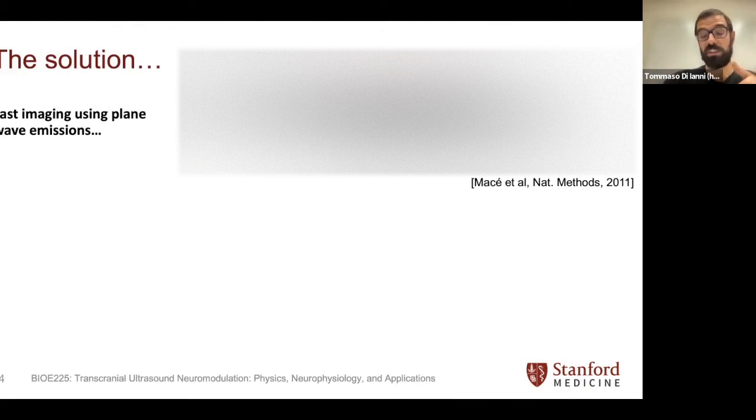Now, we can retain the receive focusing, right? Because that's something that we do in post-processing in hardware or software, but still we collect all the data and then we beamform it.